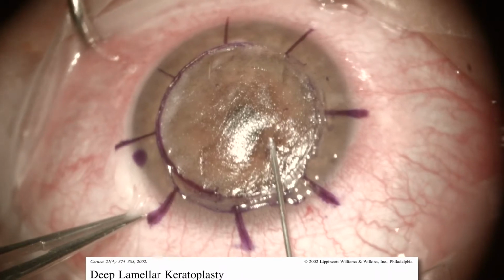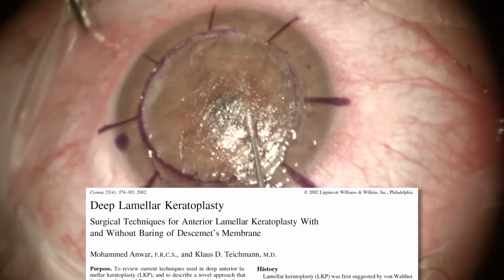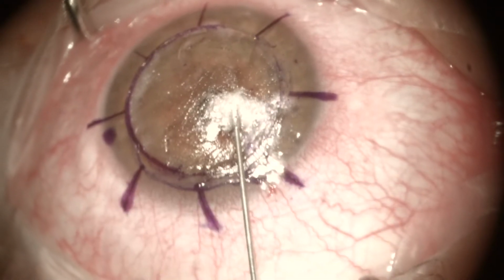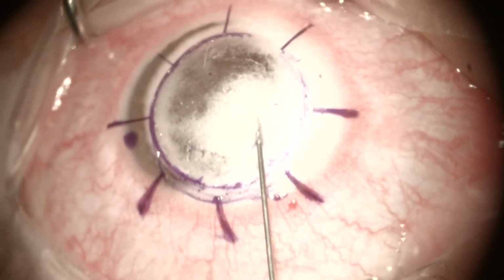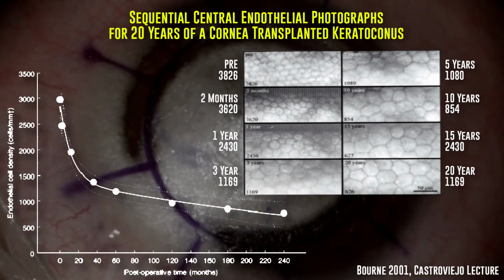Even though Anwar's DALK technique was published in 2002, it presents several technical difficulties in understanding what's going on inside the corneal tissue during the injection. This technique has many advantages over PK. The most important is the preservation of a healthy endothelium. This translates into less endothelial cell decay and avoids endothelium rejection.